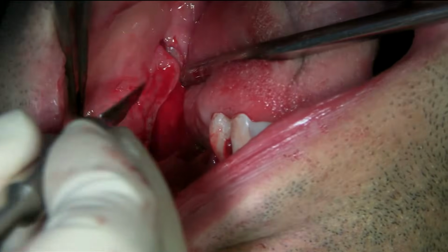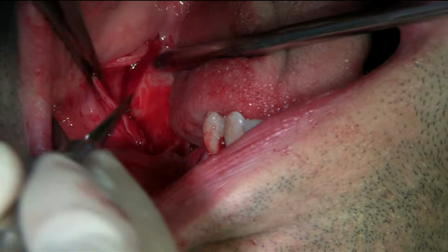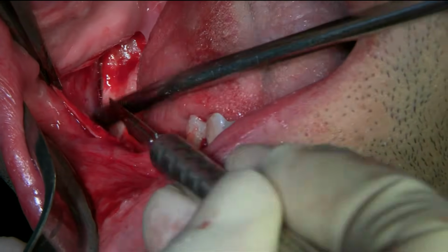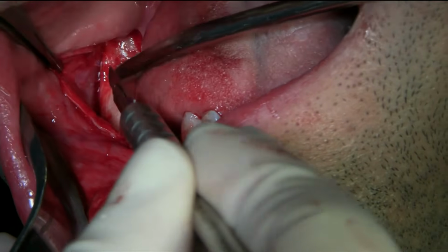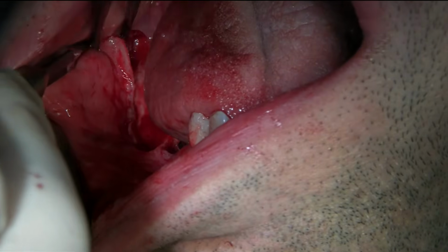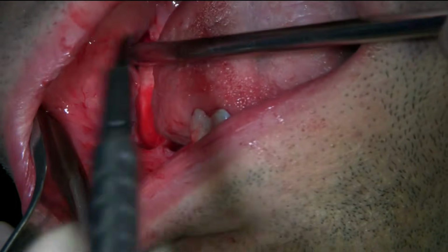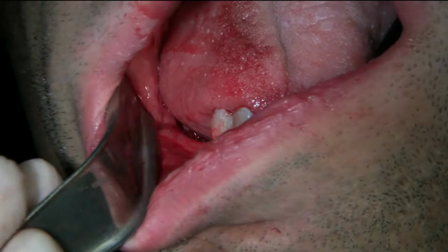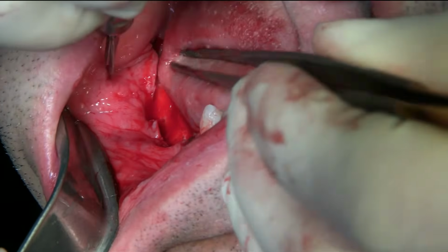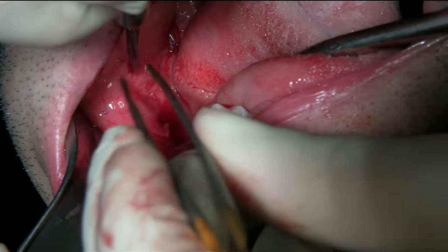Tongue. Section there. I haven't released the posterior yet. So I'm going to get there. I need to retract the tongue from this side.